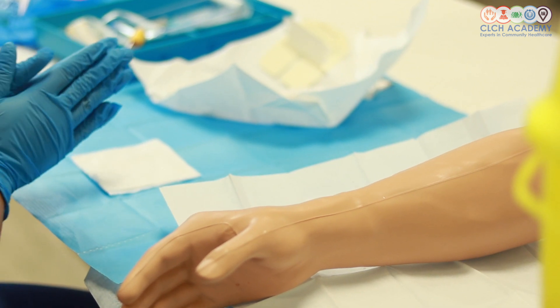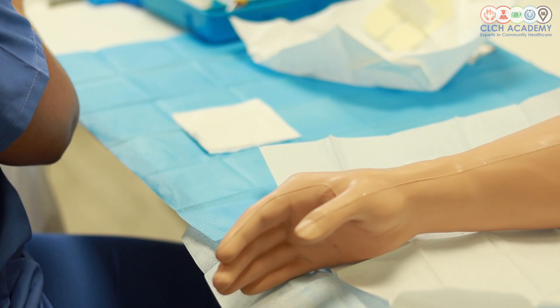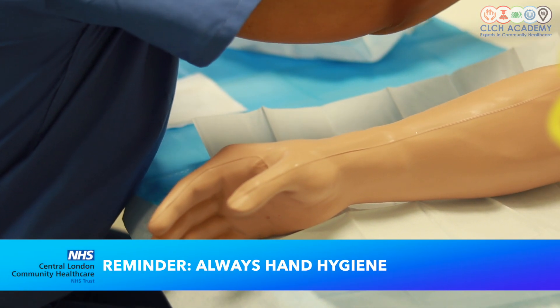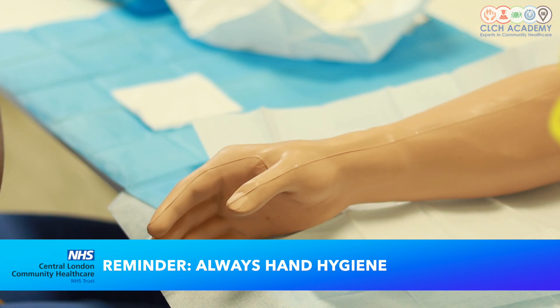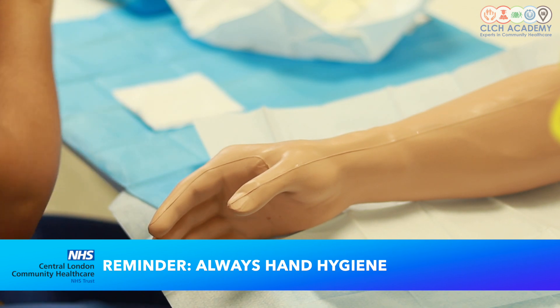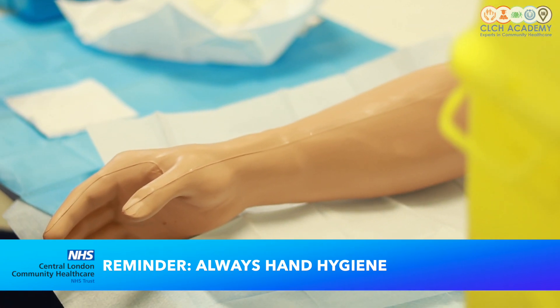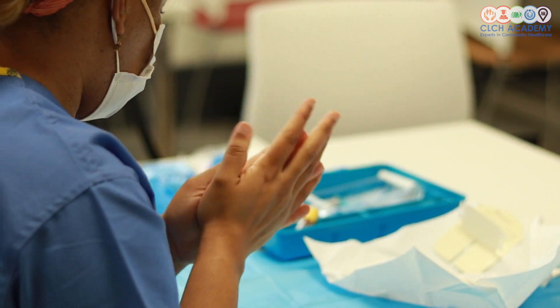My next task after this is to remove these gloves and decontaminate my hands as I get ready to actually insert the cannula into the patient. Good hand washing technique to decontaminate your hands — then I will get my gloves on.